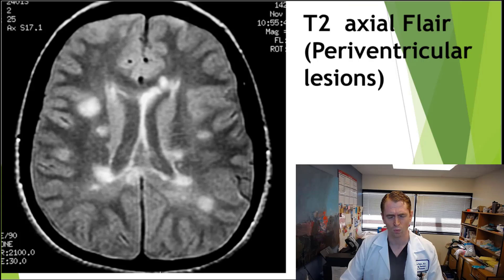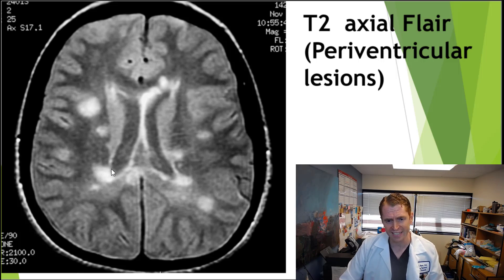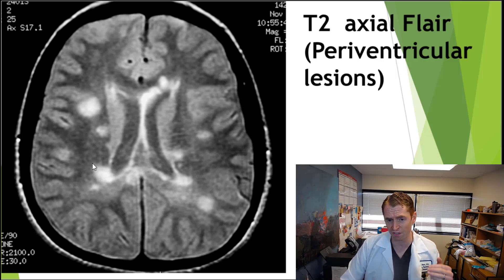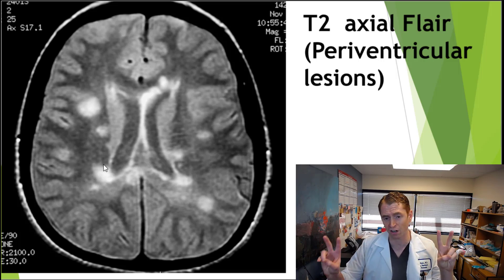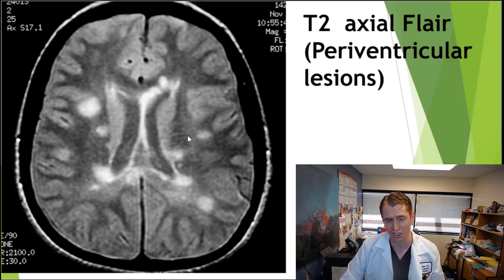Let's start by looking at features which are typical of MS on MRI scans. We'll start with this axial image going through the brain. You can see the skull on the outside and the fluid-filled spaces, the lateral ventricles. And these lesions which are periventricular — in other words, they touch the ventricles.